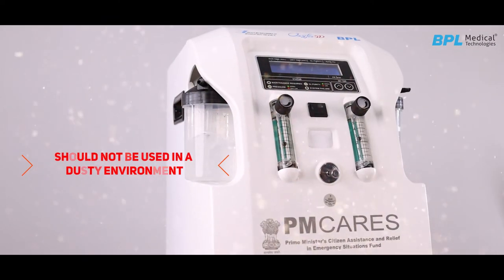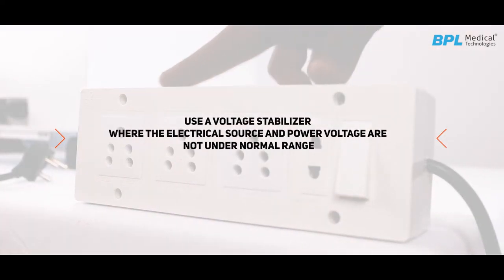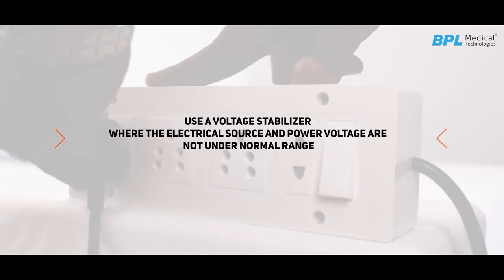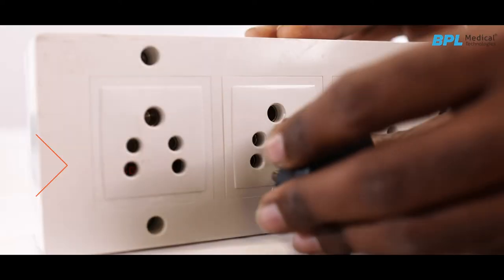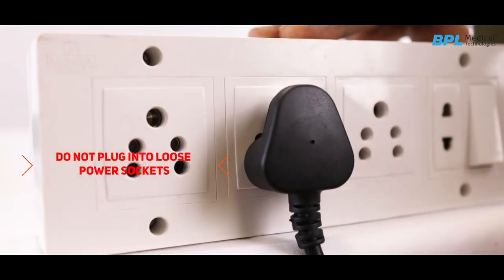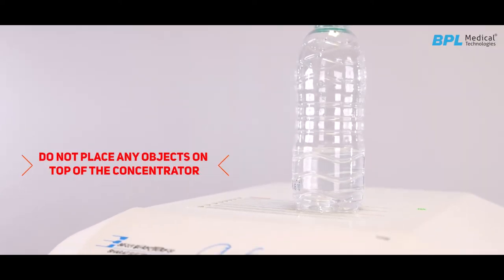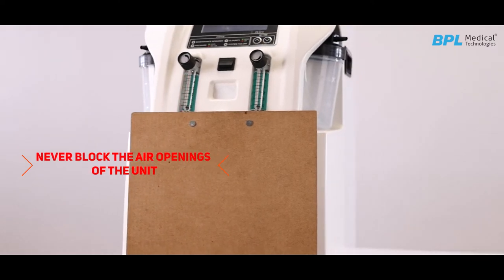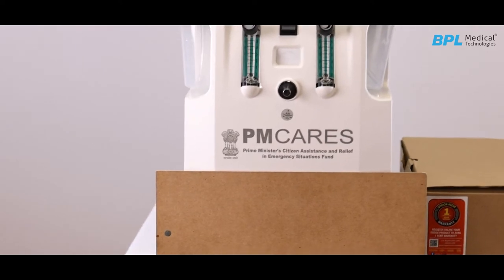The oxygen concentrator should not be used in a dusty environment. Please use a voltage stabilizer where the electrical source and power voltage are not under normal range, or in case of power supply fluctuations. Do not plug the oxygen concentrator into loose power sockets. Do not place any objects on top of the concentrator. Never block the air openings of the unit or place it on a soft surface such as a bed or couch where the air opening may be blocked.